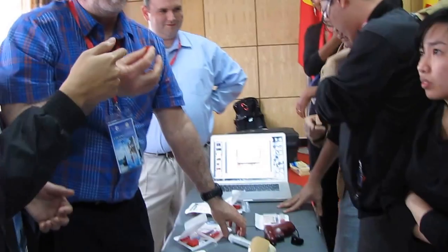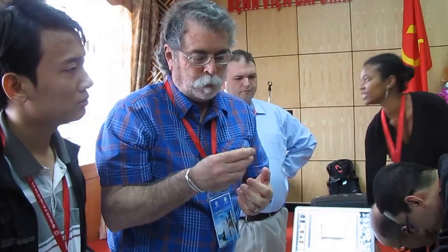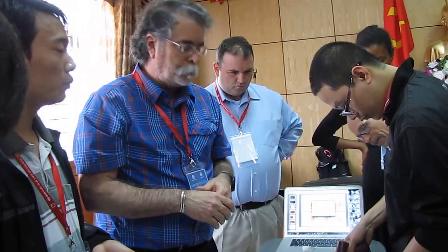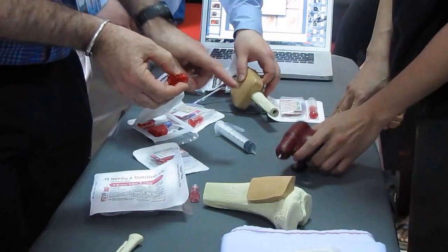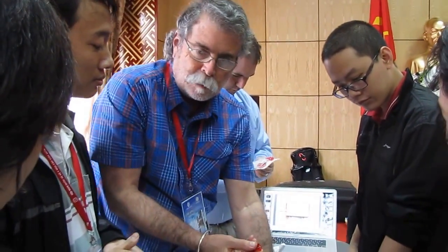Intraosseous access is an alternative to an IV. You can put the same drugs, same medicines, blood, and fluid through an IO as through an IV. The advantage in an emergency is that this is really the best option to do quickly. The most important thing is that we can administer drugs very fast. We've got the drill here, but you can use a bone needle or an intraosseous needle to place it — it does not need to be done with the drill.